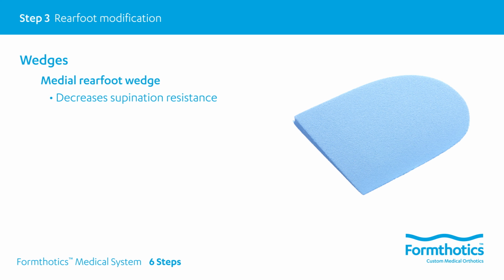By doing this, the rear foot is tilted. A medial force is applied to the subtalar joint axis, which is going to shift the subtalar joint axis laterally to reduce the pronation moment occurring at the rear foot. This can be used to stabilize someone who has excessive rear foot pronation. It may also be used to stabilize someone who has excessive rear foot pronation resulting in pain or dysfunction.